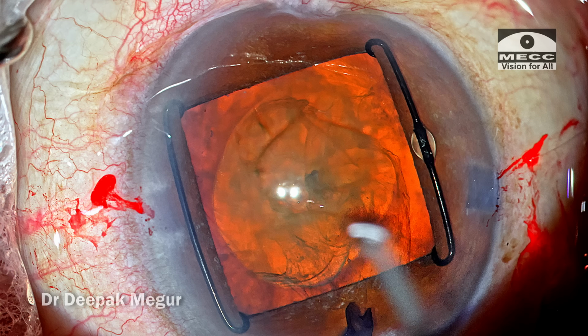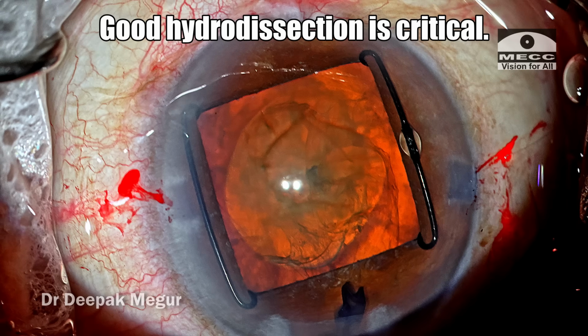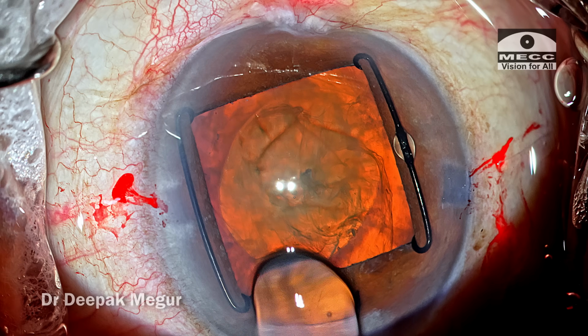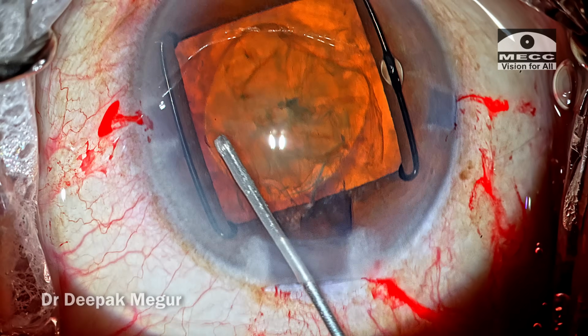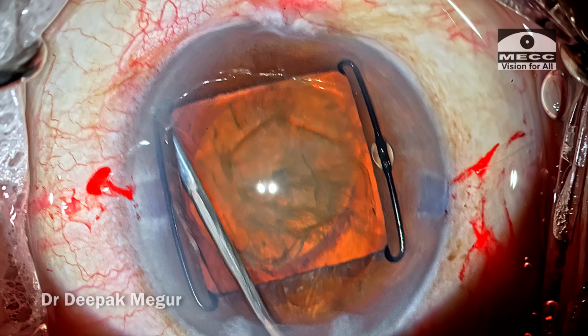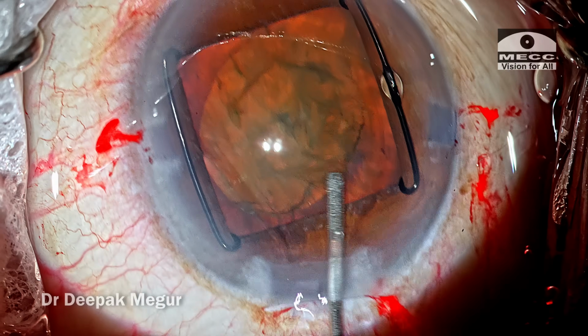Now is the time for hydrodissection. Now I believe in such eyes with generalized zonulopathy, good hydrodissection is the most important step. So this ensures that the corticocapsular adhesions are broken, and unless and until the nucleus is free from its attachments to the capsular bag, I wouldn't proceed for nucleus management.